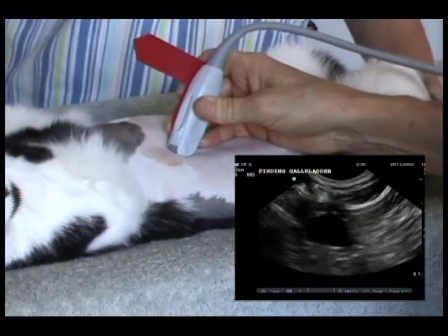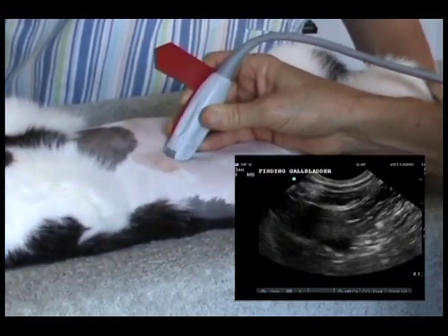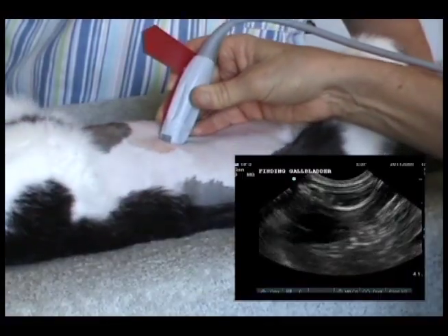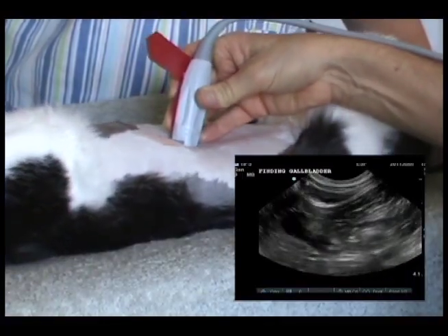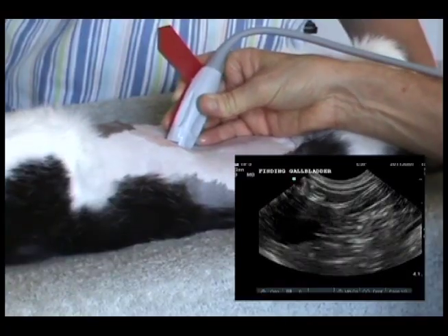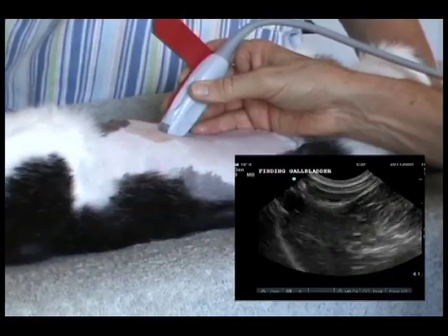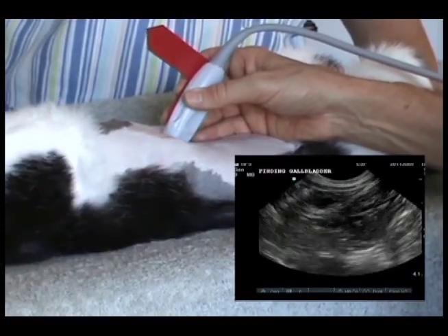Unfreeze the ultrasound machine. Fan the transducer slowly to the patient's right side till the gallbladder disappears. Then reverse directions and fan to the patient's left till the gallbladder disappears, to be sure you have seen all of the gallbladder and its contents.